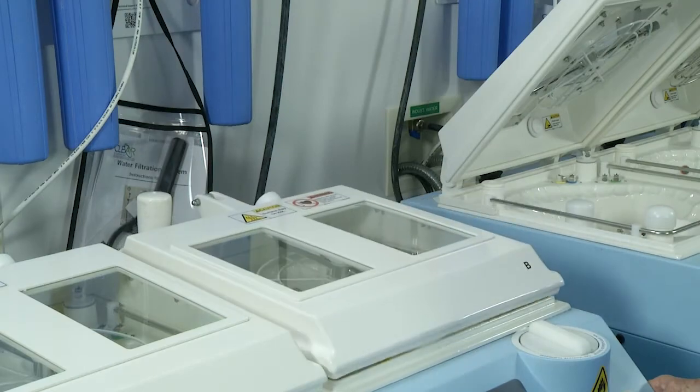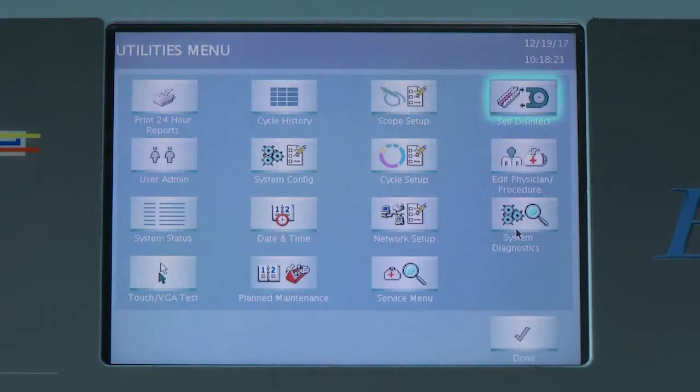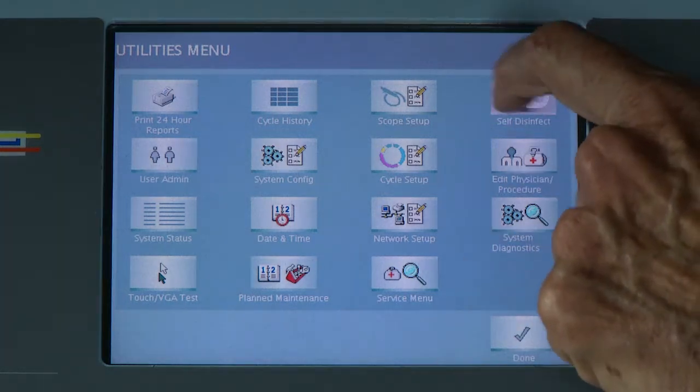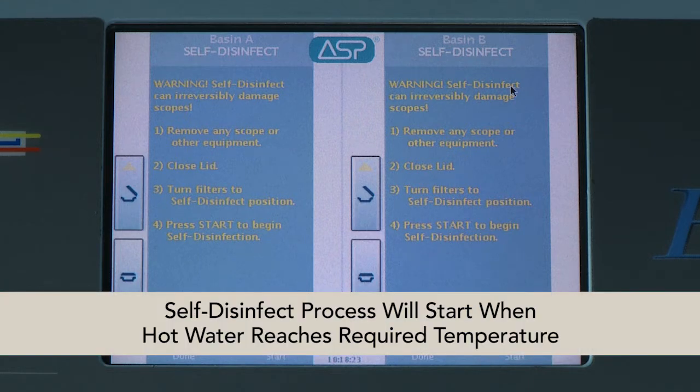Next, close both lids, then go into your utility screen and select the self-disinfect icon located on the top right of the screen. This will prompt you through the proper process and provide you a start button to initiate the self-disinfect cycle. The process will start when the hot water has reached the required temperature.